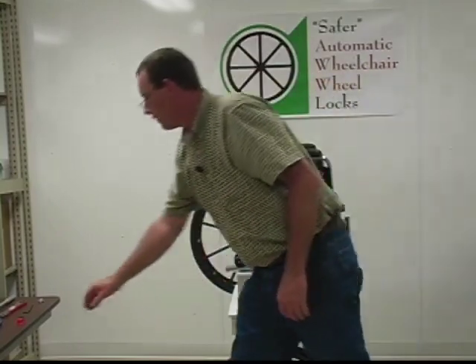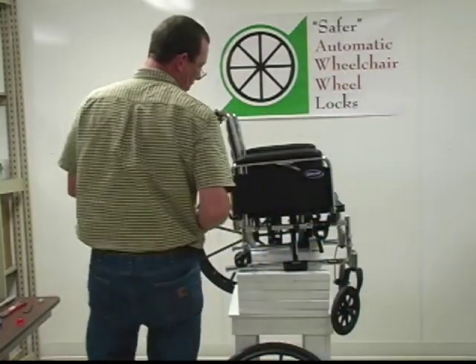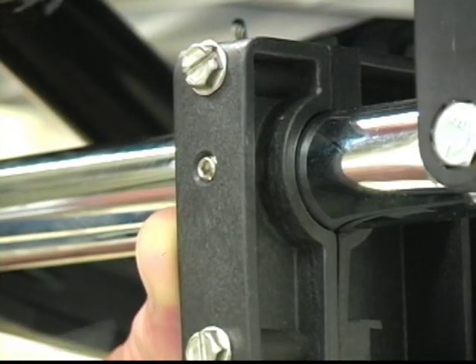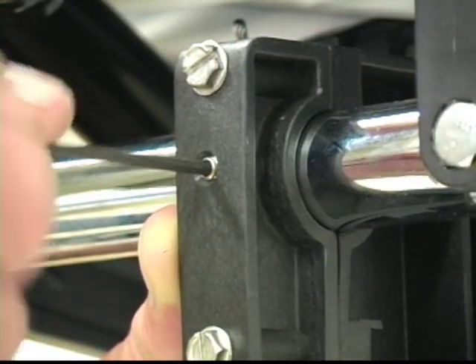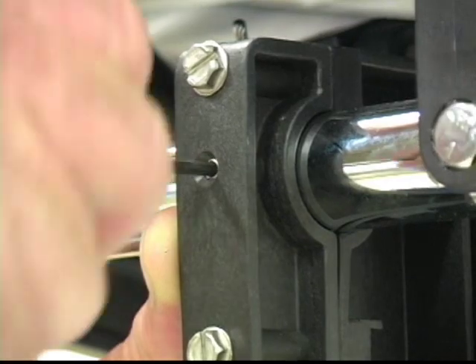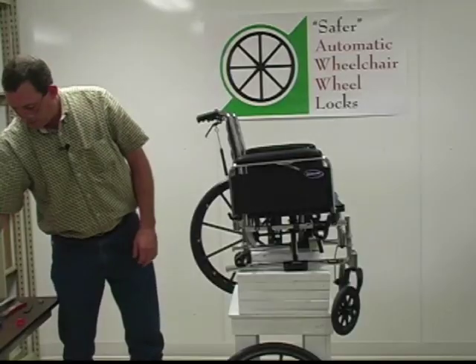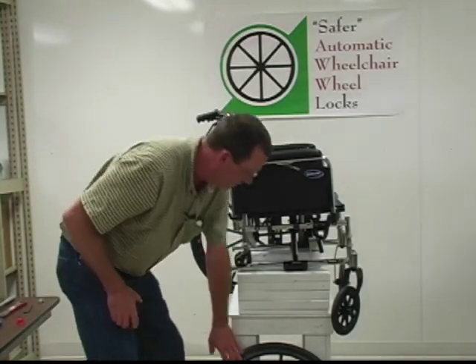down the road. From that point, we'll take an Allen wrench supplied in the kit, and we're going to tighten the set screw up here. Now what this set screw does, this is going to hold this kit in place while we get everything put together, test the chair, and then we'll have a way to attach this permanently to the frame later on. From that point, we're ready to reinstall our wheel.